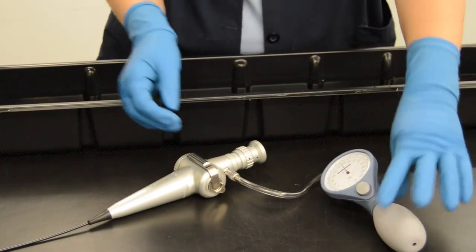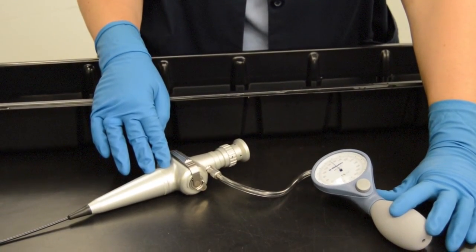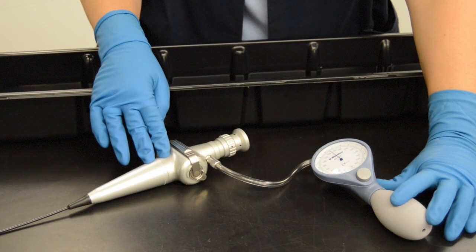Observe the needle for 10 seconds. If the needle drops, the leak tester connection to the endoscope may be loose. Repeat procedure to verify.